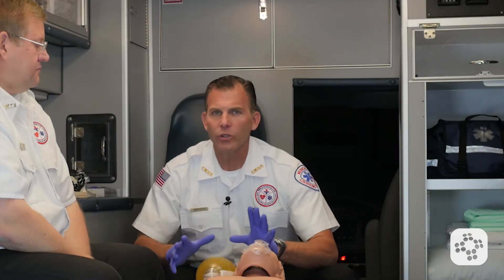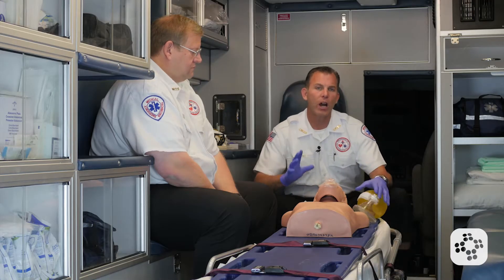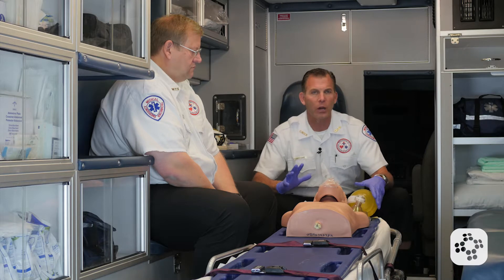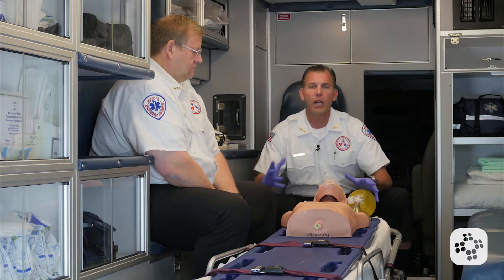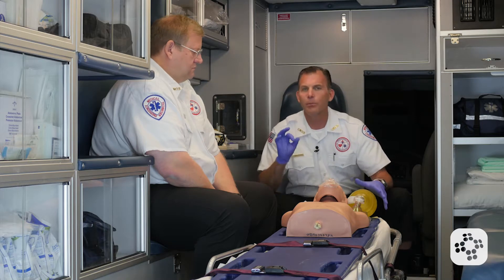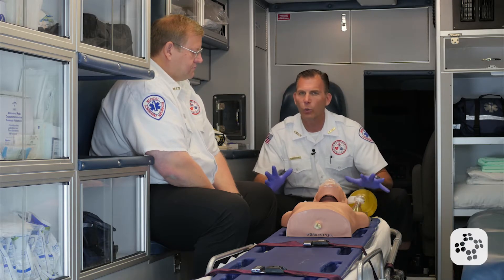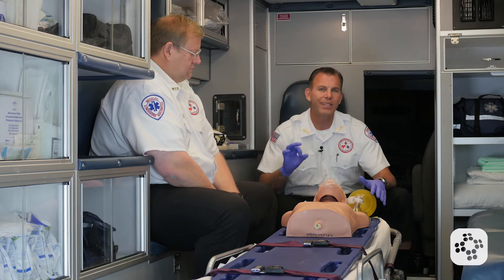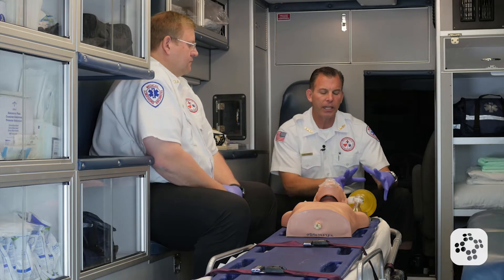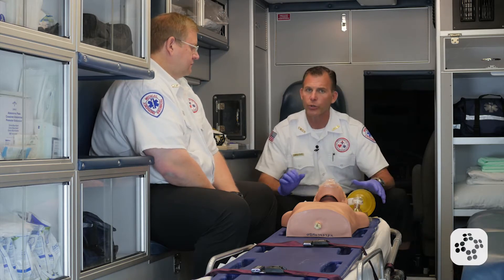Now let's cover the particulars of the bag valve mask. It's important for us to talk about several aspects without deliberating too long — why we would use a bag valve mask, what it is for, some pitfalls we can accidentally get into if we're not aware of how to use it properly. I'm going to go through them as systematically as I can and explain how we use it, why we use it, and with what adjuncts we use it.